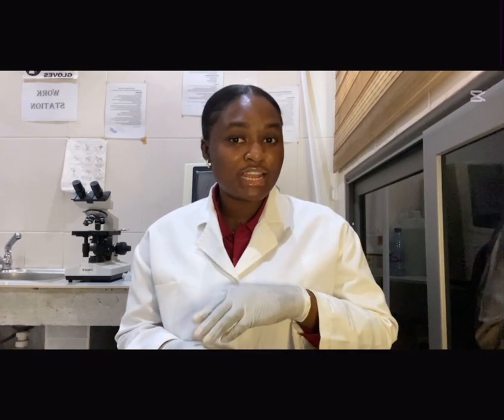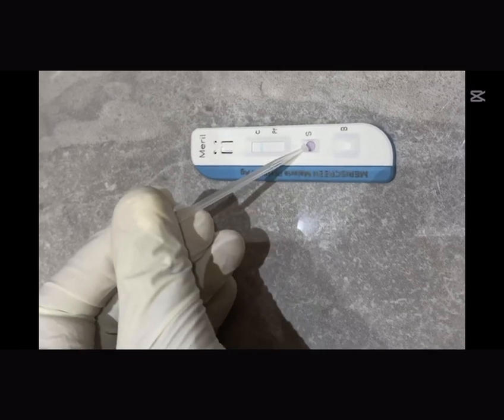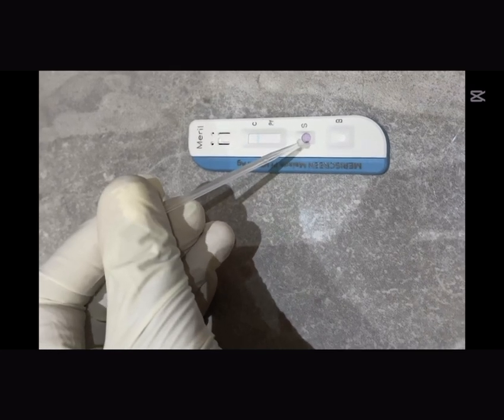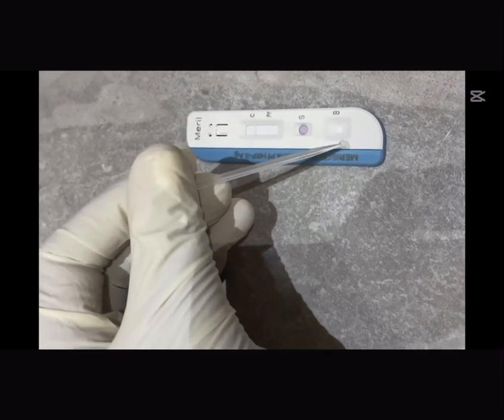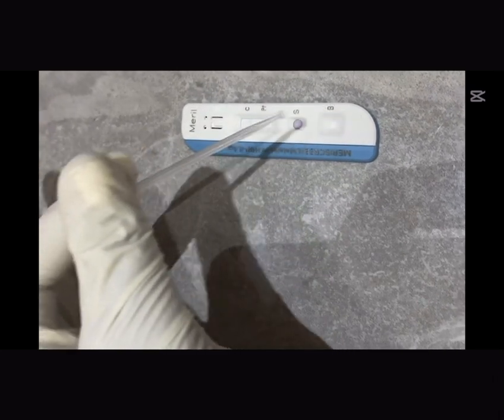Now to question number two: where do we put the blood and where do we put the buffer? This is a very important question. You need to understand that there are different brands of malaria test kits on the market, and each of them comes with its own designated area. On the test kits we use, you'll notice two small wells — one labeled S and the other B. The S stands for sample, exactly where we put our blood sample, and the B stands for buffer, where the buffer for the test goes.